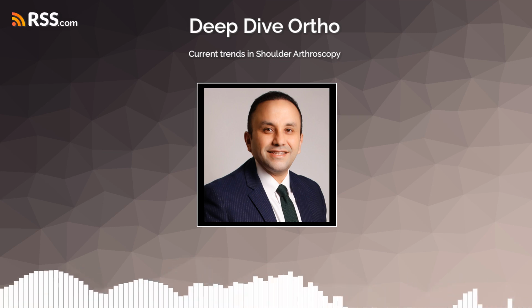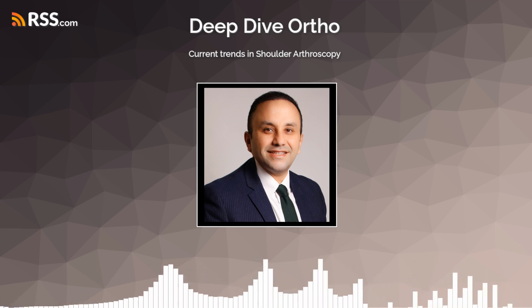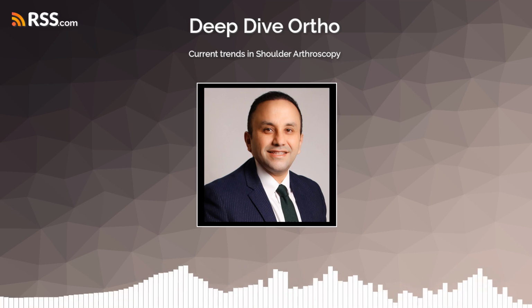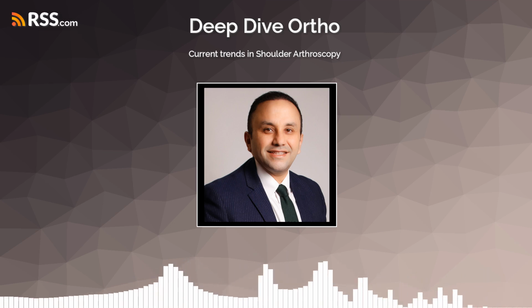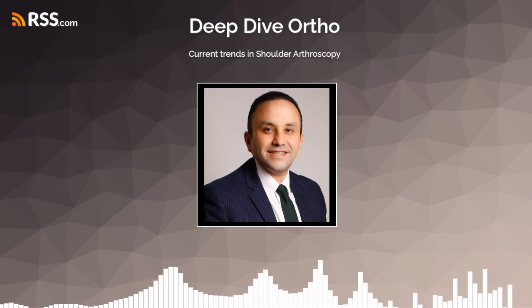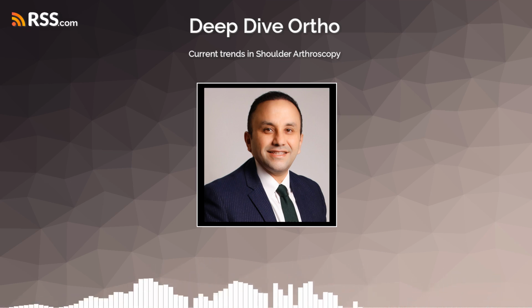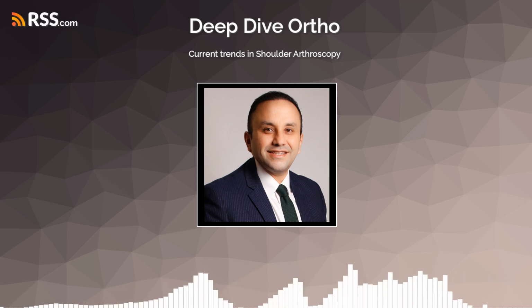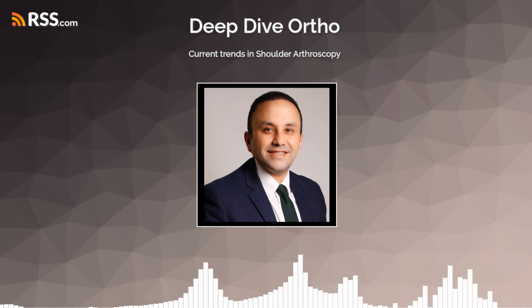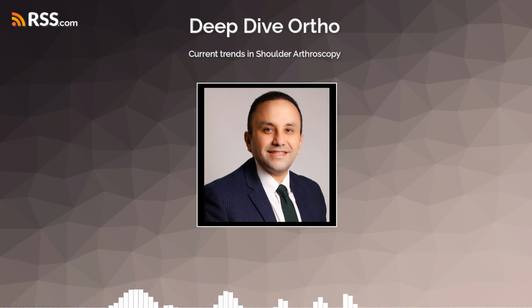Is it harder to do? Performing arthroscopy in a shoulder that has already had a replacement is definitely technically more challenging. The anatomy is altered, you have the implants in the way, and scar tissue can make visualization difficult. So it really requires a surgeon with significant experience in this specific area. Often, a posterior portal, an entry point from the back of the shoulder, is preferred in these cases to try and avoid the implants at the front.